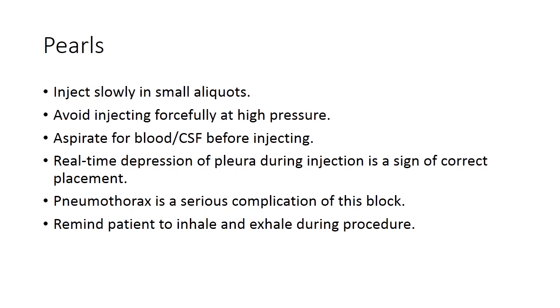Real-time depression of pleura during local anesthetic injection is a sign of correct placement of needle tip in the paravertebral space for single-shot block and catheter techniques. Echogenic needles for PVB placement may further aid needle visualization. Pneumothorax is a serious complication of this block.